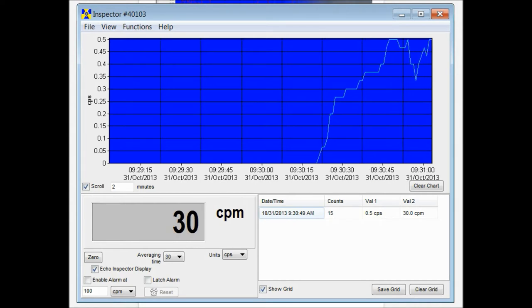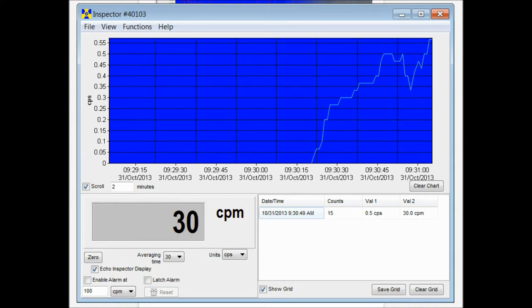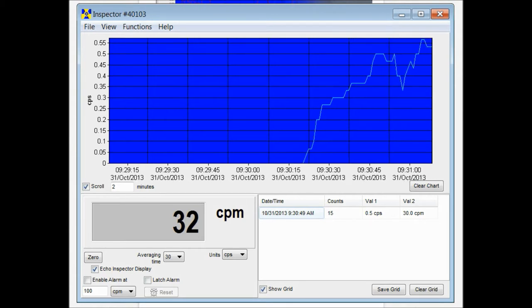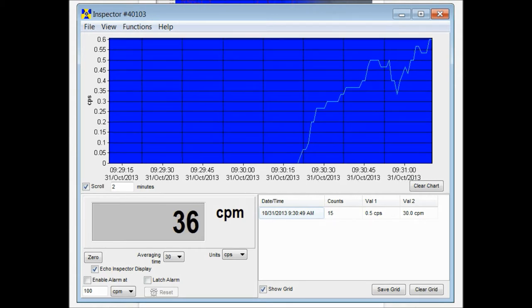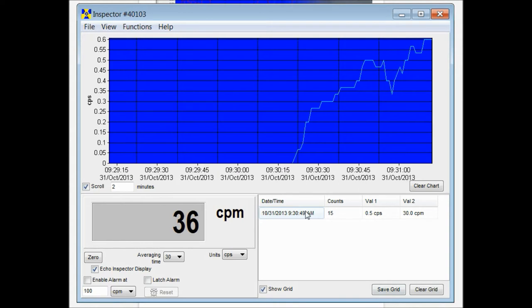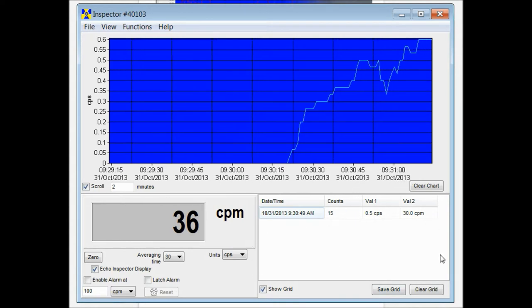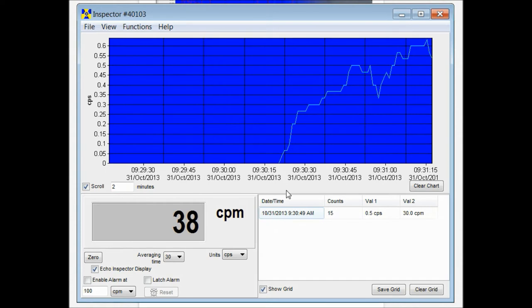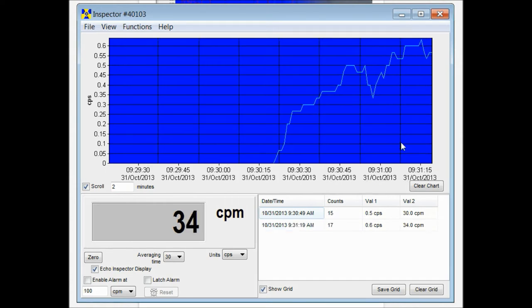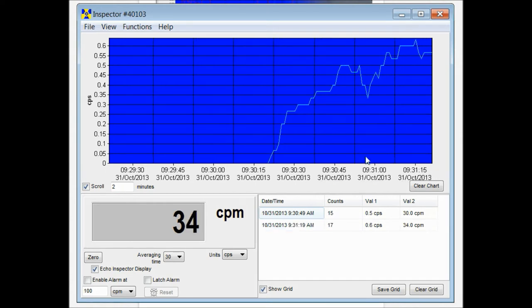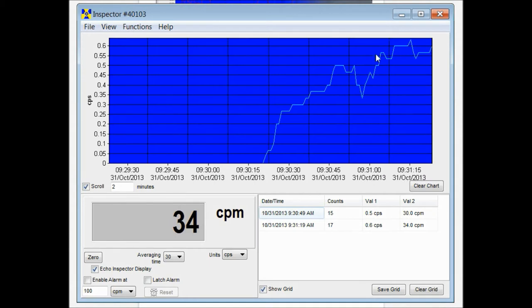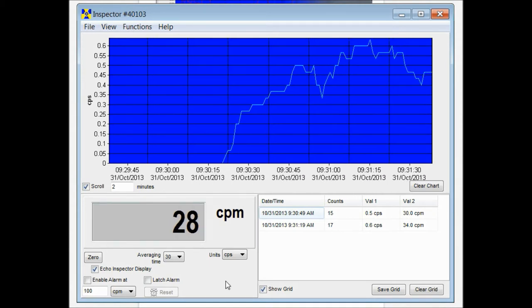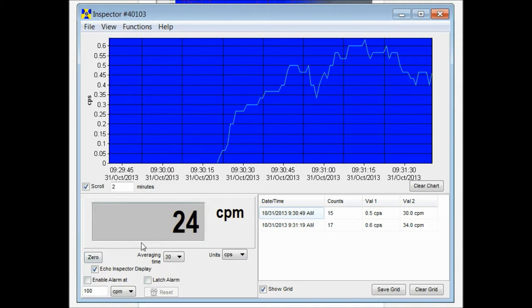The software window is broken up into three different sections. Right here you have your grid. This is going to record periodically and create a spreadsheet for you. Up here you have your chart. This is collecting the live data that's coming off of your device. And in the lower right you have a window that will mirror the display.